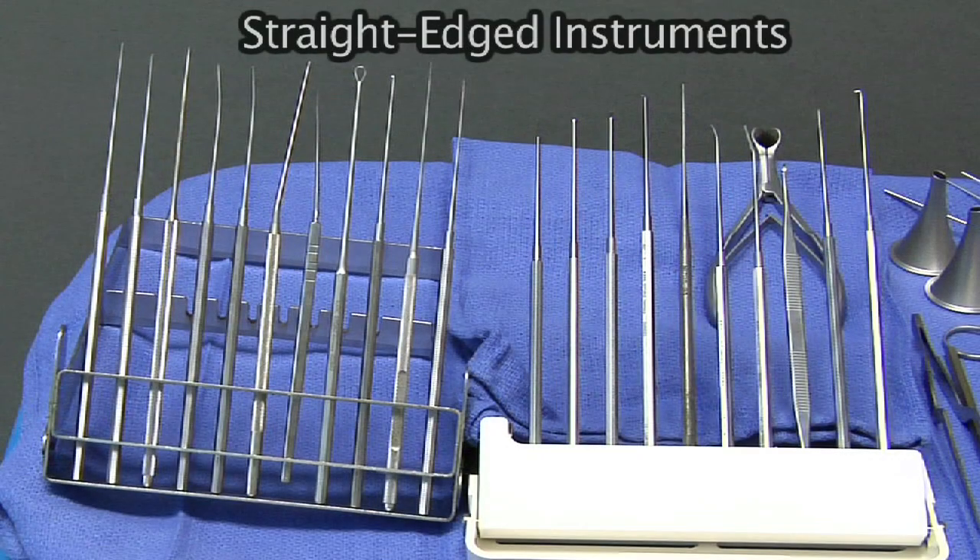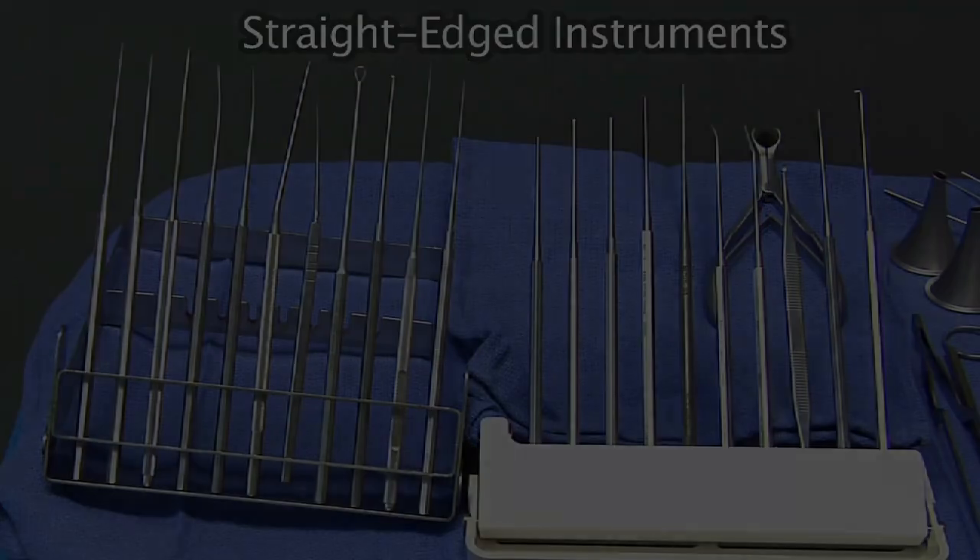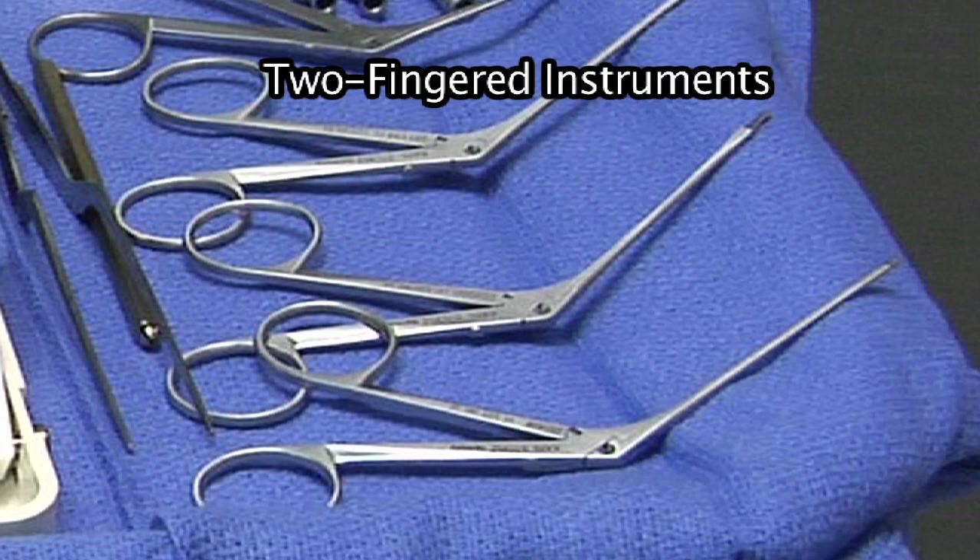In ear surgery, you have two types of instruments: you have the straight instruments that have something different on the end, or you have the two-finger instruments that are used.